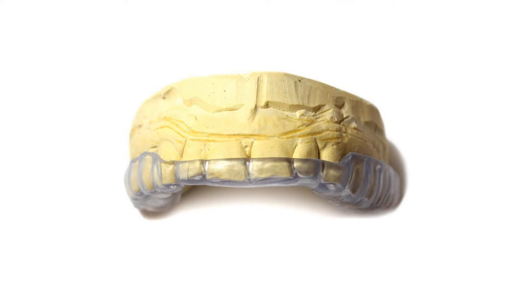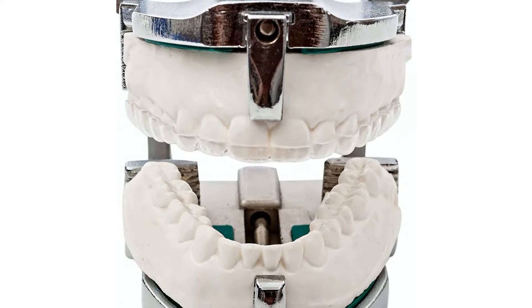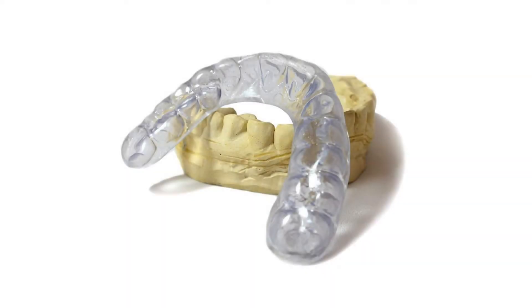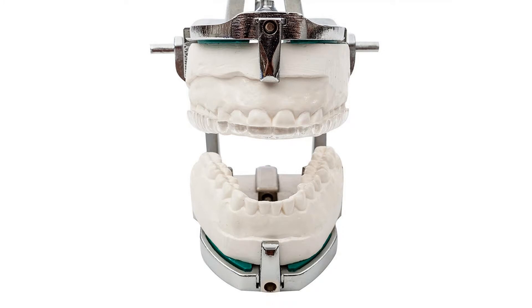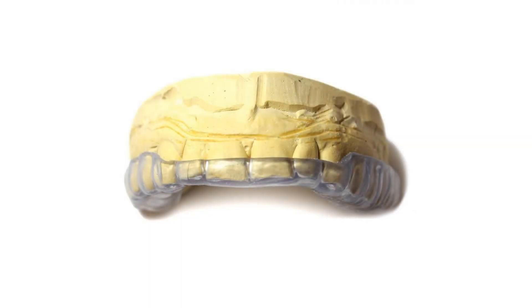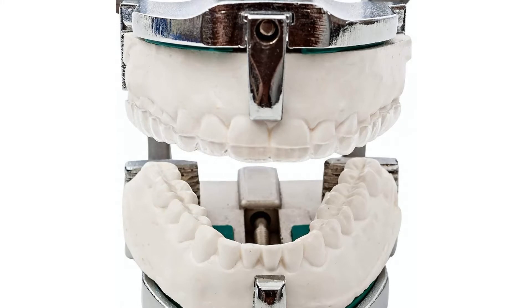Once you order from us, you will receive an impression kit with three different sizes of mouth trays to choose from. Our simple impression process can be performed at the comfort of your own home in about 5 minutes. Simply follow the detailed instructions provided in your impression kit, then send your impression back with our prepaid shipping label. In no time, you'll receive your custom night guard at your doorstep.